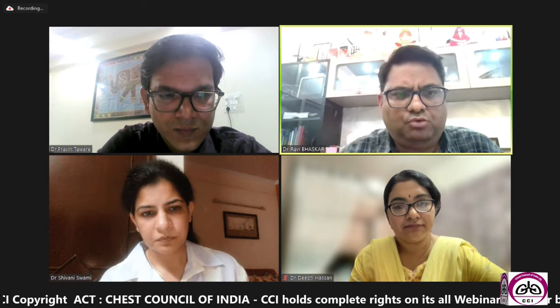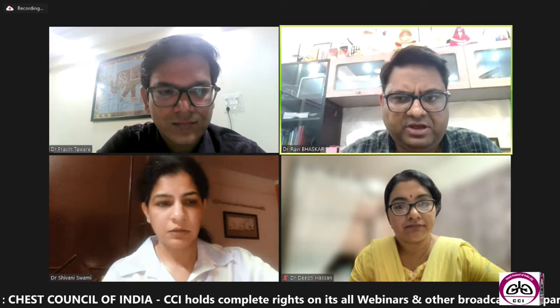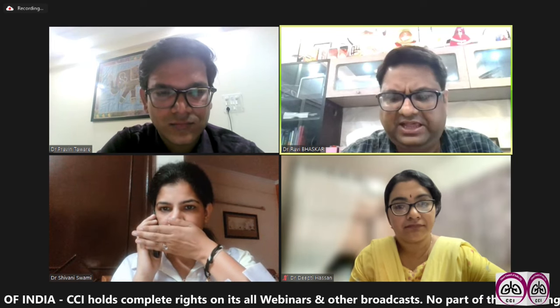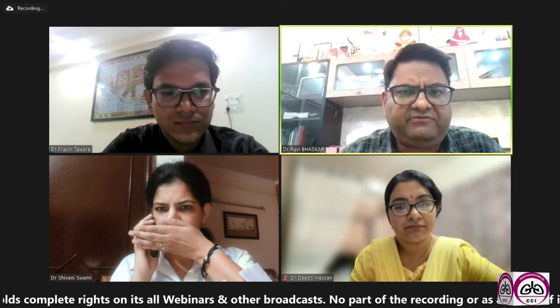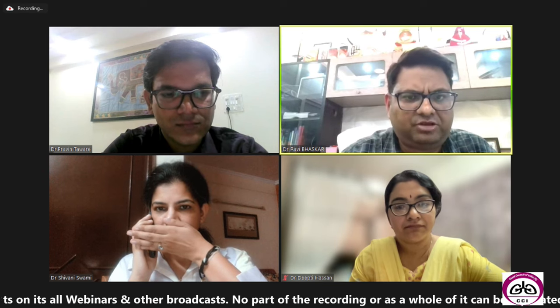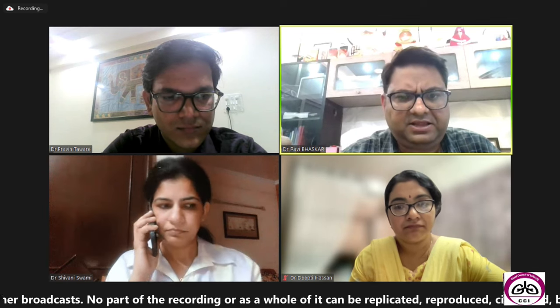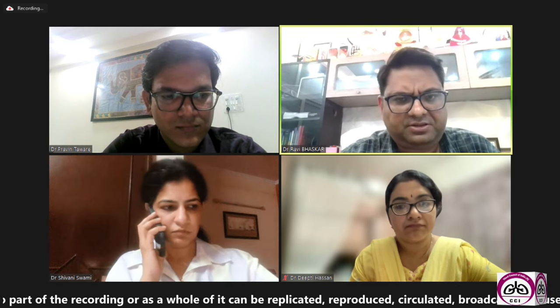What I think, especially neurological patients who have developed some sort of neurological problem and have poor hand-mouth coordination, then this subgroup of patients, or sometimes when there is very severe disease, severe bronchospasm, and the patient is not getting admitted in hospital, then because larger doses are needed, I think in this subgroup of patients it's better to go for home nebulization.